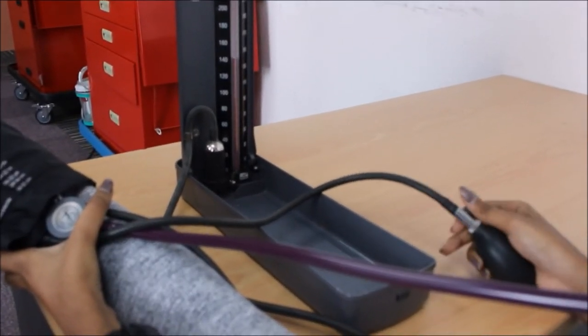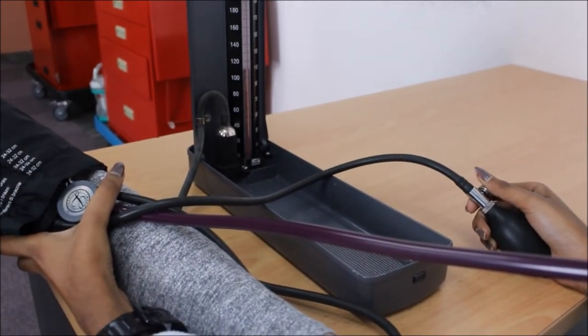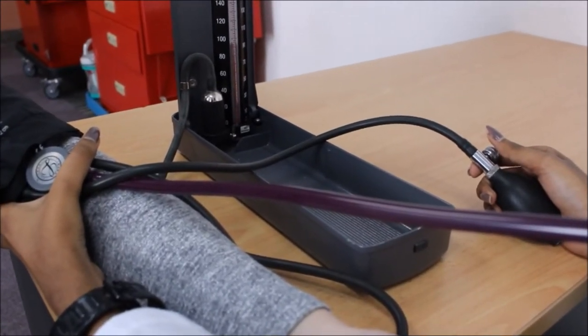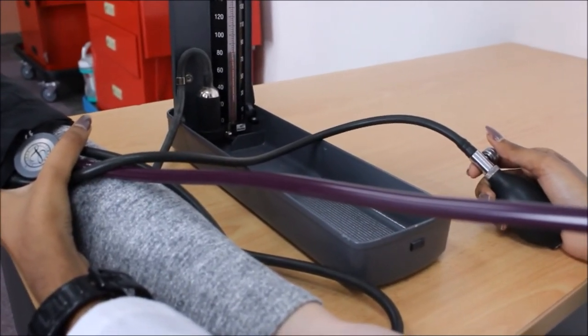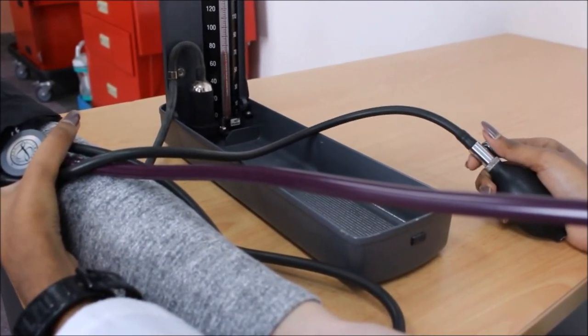Release the air from the cuff at a moderate rate of 3mm per second. The first Korotkoff sound will be the patient's systolic pressure, while the last Korotkoff sound will be her diastolic pressure.